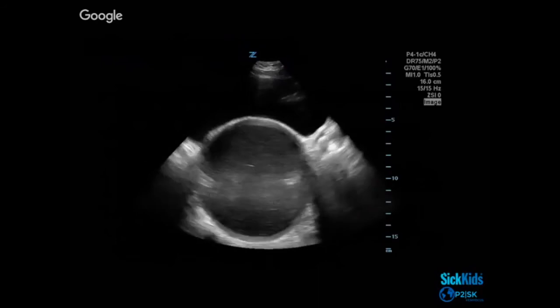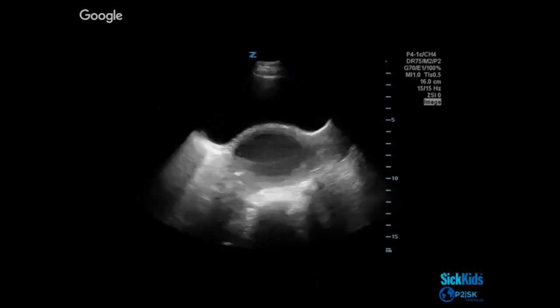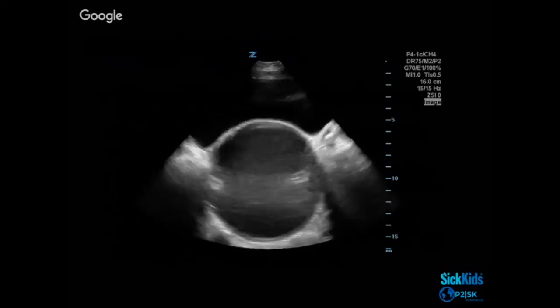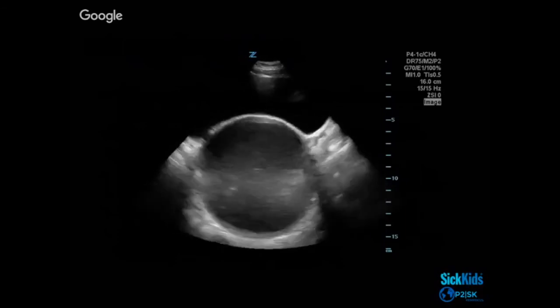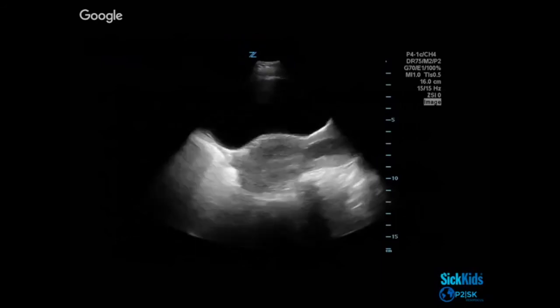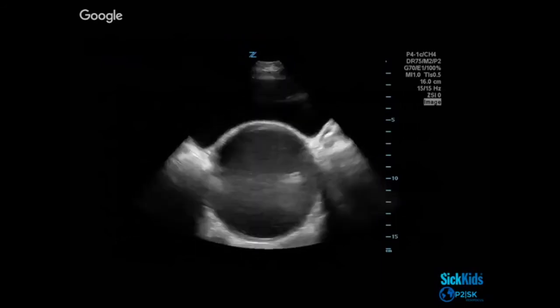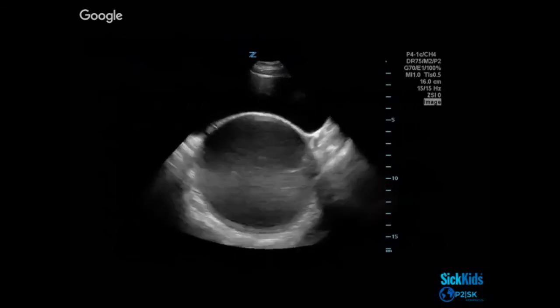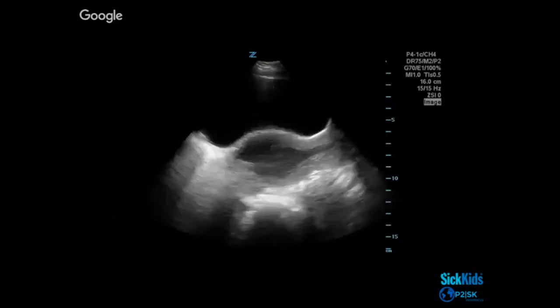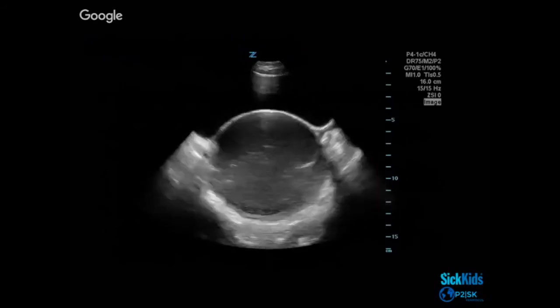She has another finding on this ultrasound other than her hematocolpos. She has a bicornate uterus. So she had an imperforate hymen over one of her uteri, and the other one had proper shedding through a perforate hymen. So what she actually had was effectively a very deep bicornate uterus, and one of them was blocked off, but the other one allowed her to have normal menstruation, which is why it took a great deal of time for this particular thing to be diagnosed. So it's important in a hematocolpos history to be sure to ask that.